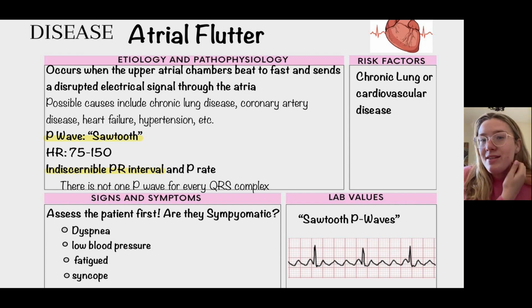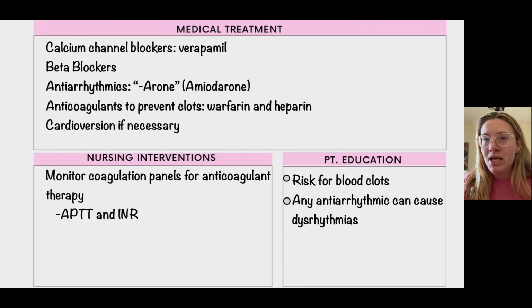What do we do if we see this on the monitor? Knock on your patient's door, check in on them, give them a little wave. How are you doing? Are they symptomatic? Are they short of breath? Do they have a low blood pressure? Do they feel very fatigued?